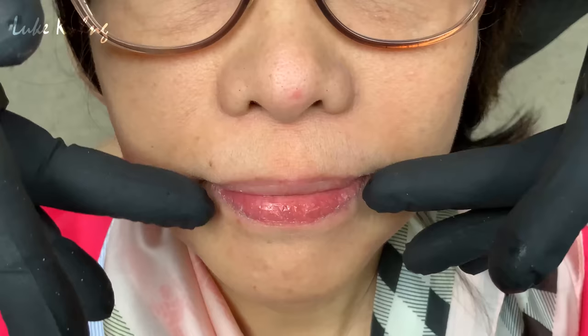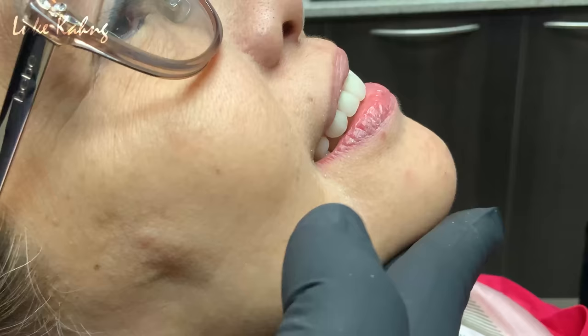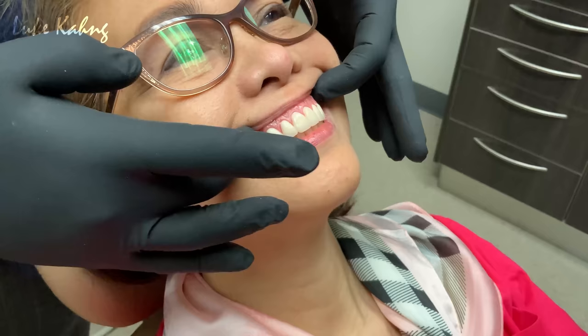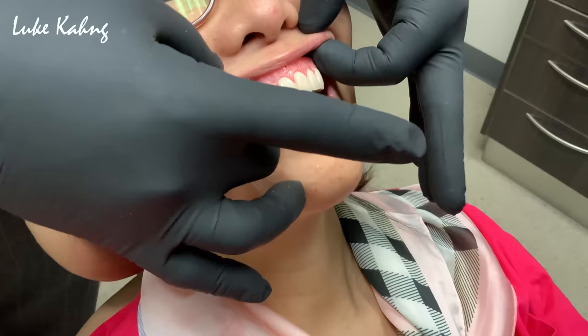And then I also take a look at it from the side. So come in from the side this way. You stay straight. And what I wanna make sure is that these teeth are not protruding out too much and that they look natural, okay? So these are the things that we look for at this point. I'm gonna go ahead and just check her bite to make sure that everything is within occlusion before I send it in to Luke to fabricate.